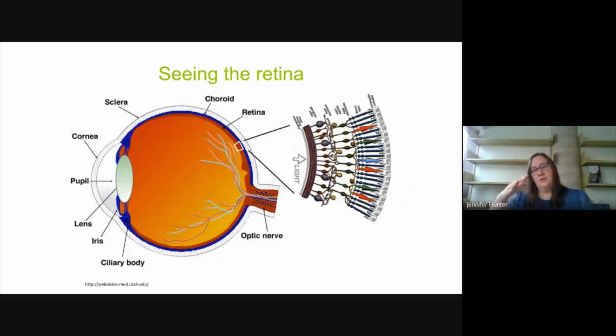So think of the retina as sort of our sample in a microscope. And if you think of the optics of the eye then as the objective lens of the microscope, it's going to allow us to image in and see what the back of the eye looks like. Now, a lot of you are working in vision science, working on different properties, and a lot of you will know that the optics of the eye are actually quite poor. And so if you were ever to go out and buy an objective lens for your microscope that had the optics of the eye, most people would laugh at you. They'd think this is ridiculous. But yet that's what we're working with.